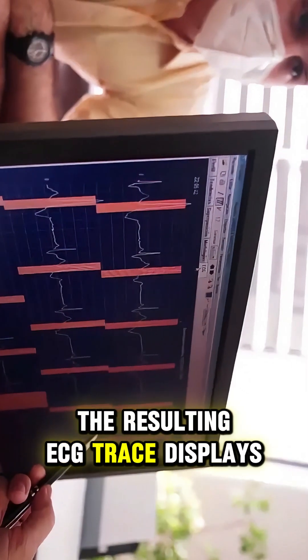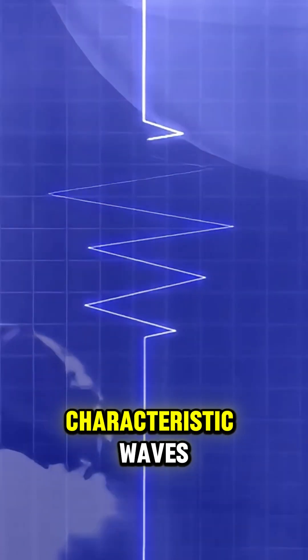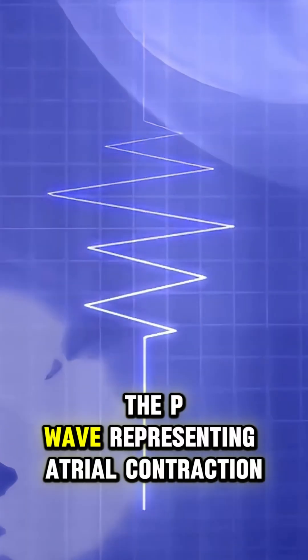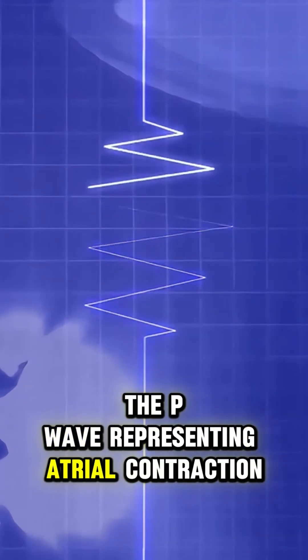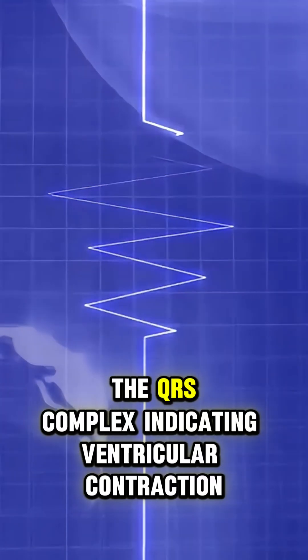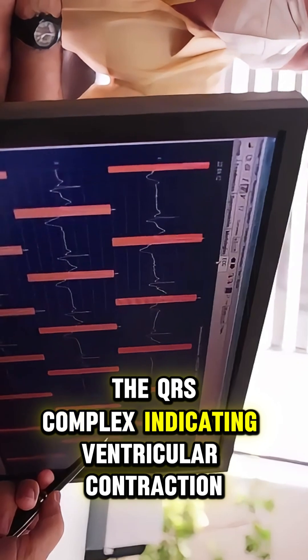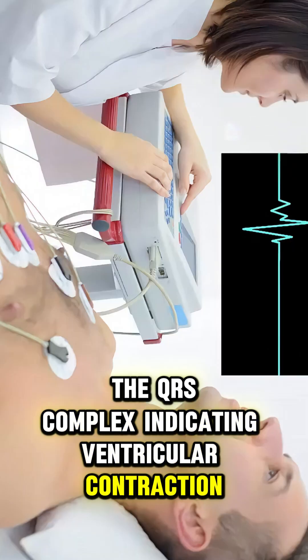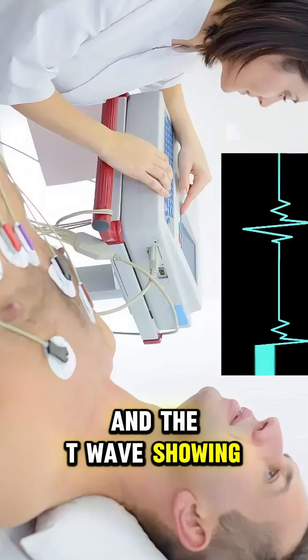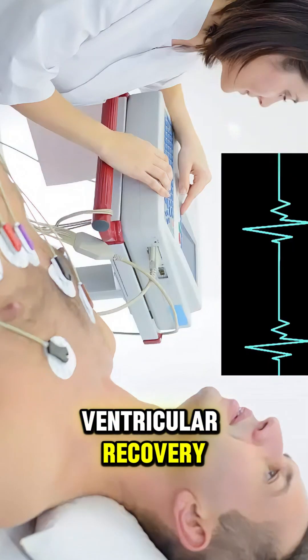The resulting ECG trace displays characteristic waves: the P wave, representing atrial contraction; the QRS complex, indicating ventricular contraction; and the T wave, showing ventricular recovery.